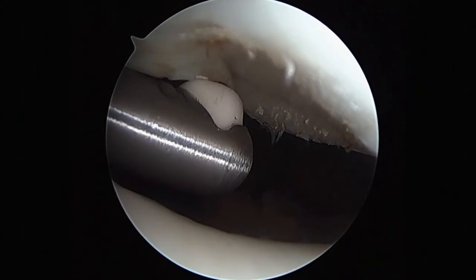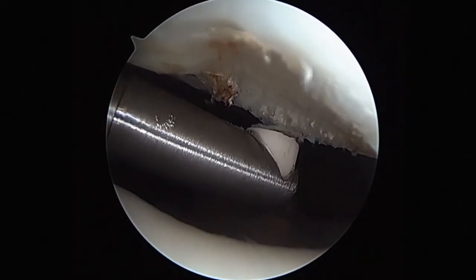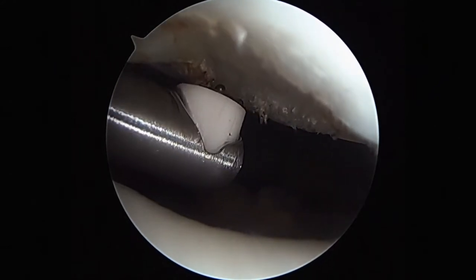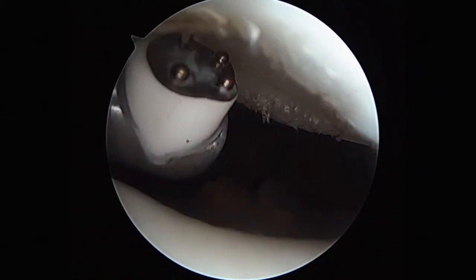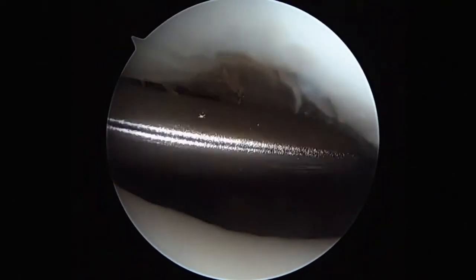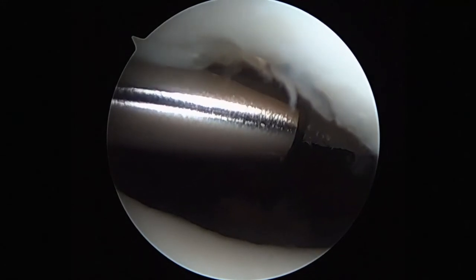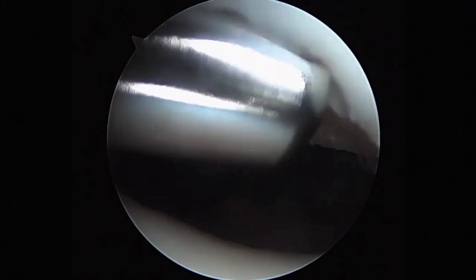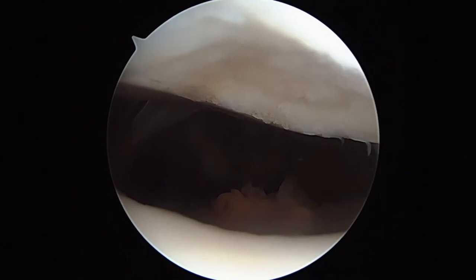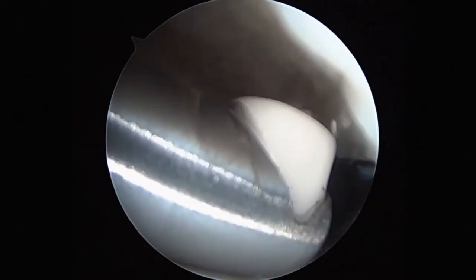I have found that the technique with the surface energy wand initially stabilises the chondral surface, but it is often necessary to exchange the wand and the chondratome to produce the smooth surface that I'm after for a finished product. It may require the exchange of a wand and a chondratome one, two, three, or as many times as necessary.